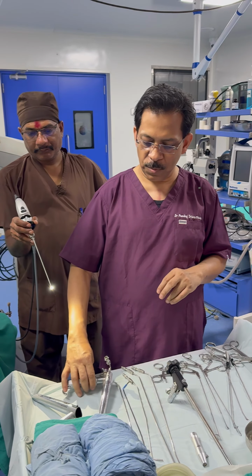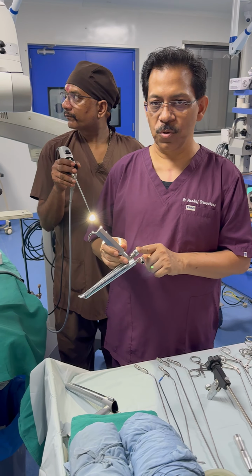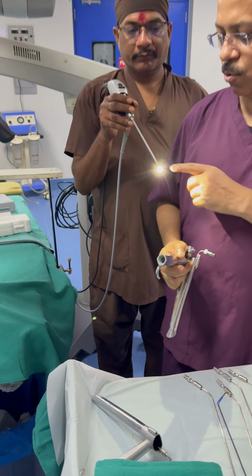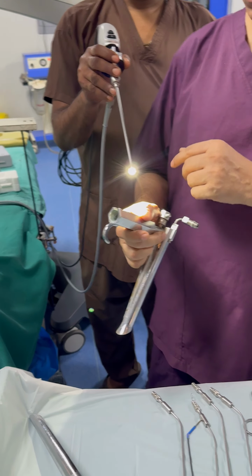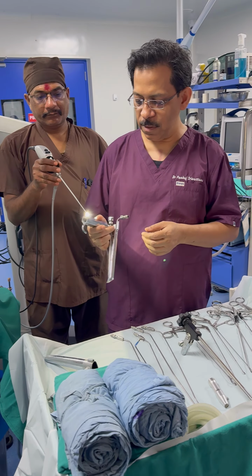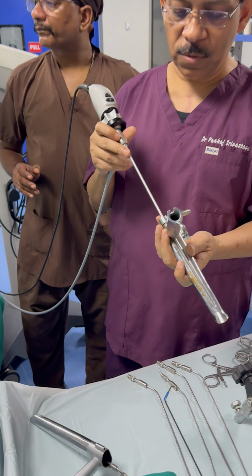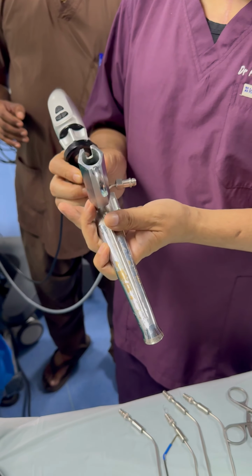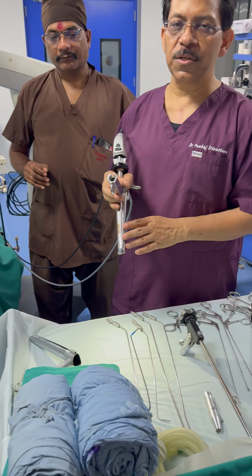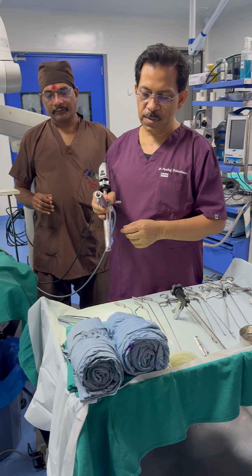Now what is the next option if the lesion is not visible or anteriorly placed? So we have this endoscope laryngoscope. In this there is a tilt anteriorly, and even the 0 degree, which is wide angle, is able to see all around very well. So there is no need for 30 degree or 45 degree endoscope. So when we attach a 0 degree endoscope in this laryngoscope and lock this, vision is improved instantaneously. But the limitation is we will have to use either cold instruments or radio frequency.